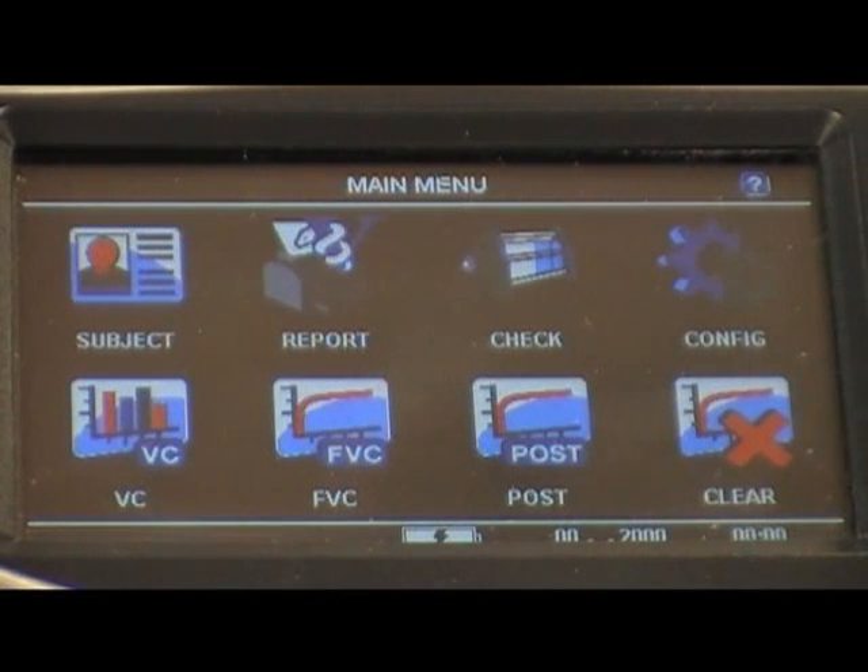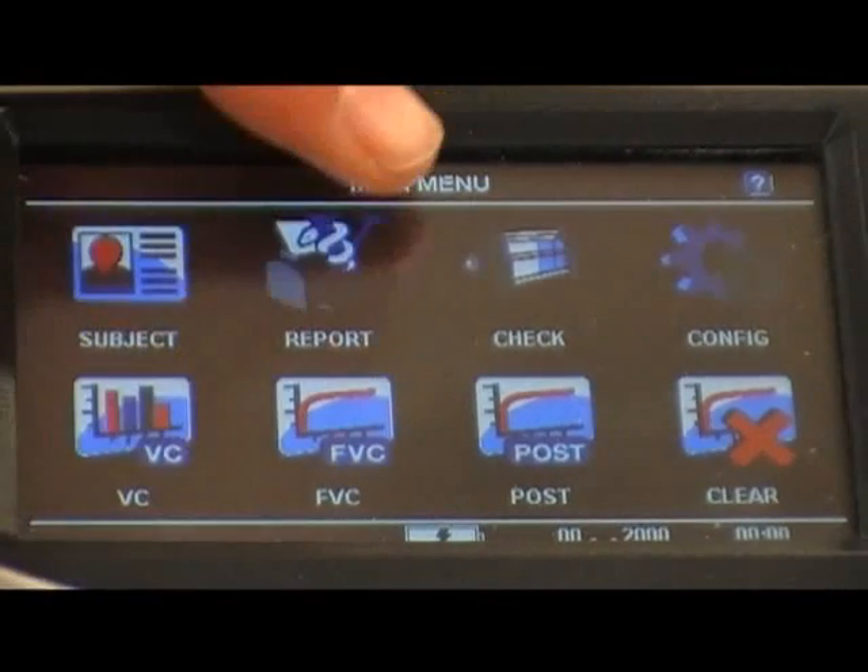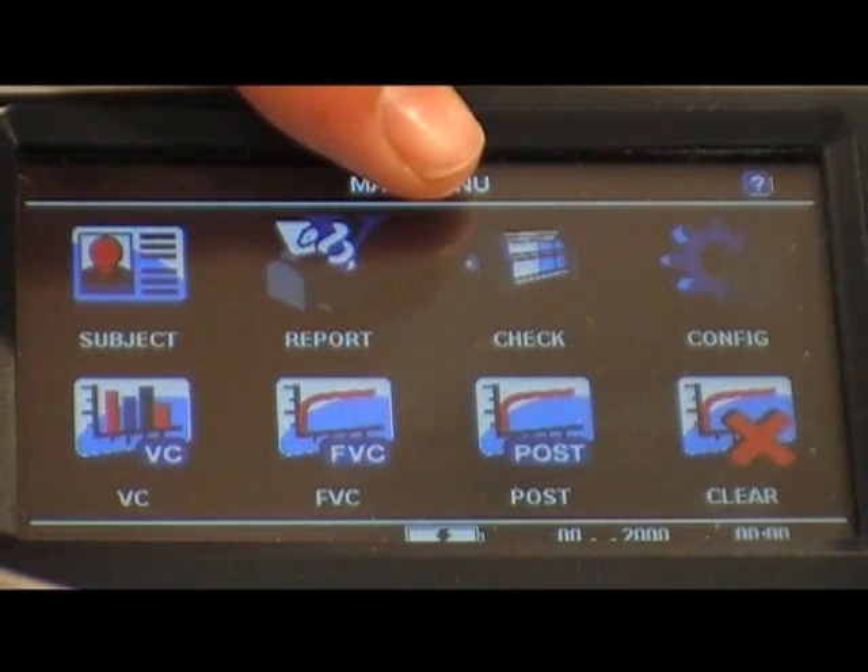Spirometry standards and clinical guidelines recommend that an accuracy check be performed on a spirometer at the start of each testing day. To perform an accuracy check on the AlphaTouch, click on the Check Accuracy icon and follow the on-screen instructions.